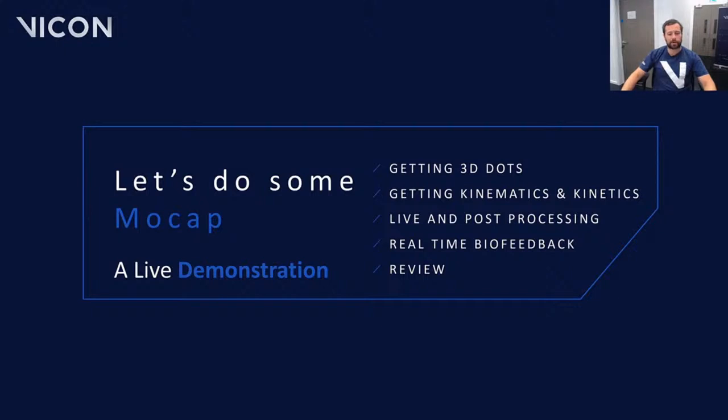Let's get into mocap then, from capturing the raw data right through to processing our trials, running a biomechanical model, and displaying human kinetics and kinematics. During the demo, I will capture and process some simple gait data to show the motion capture pipeline using the conventional gait model, and then I will capture some functional movements and calculate the hip and knee joint centers using SCORE and SARA. So I'm going to change my webcam now so that you can see our volume, and I'm going to switch my screen so you can see Nexus.